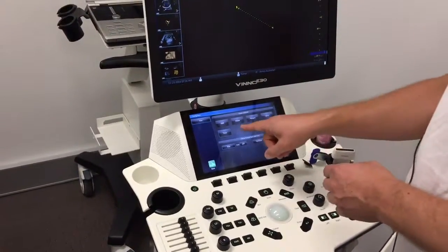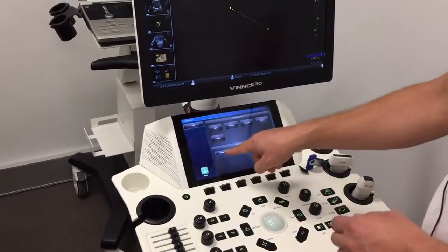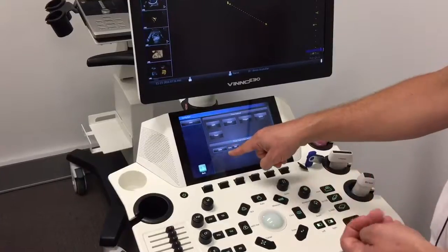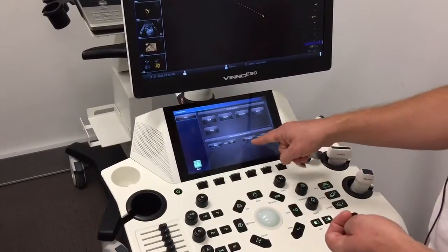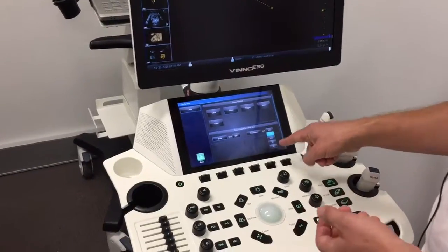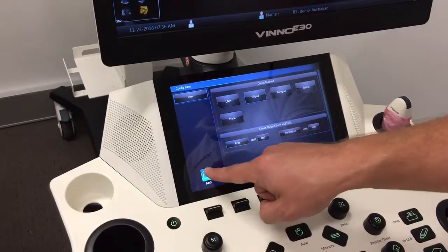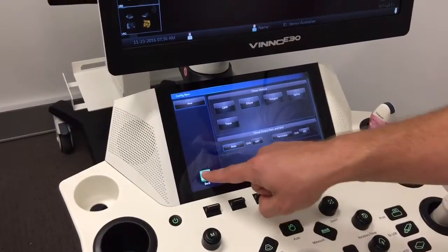For example, some people prefer ellipse to tracing. If we select ellipse, it'll also give you the option of measuring in centimeters squared. The perimeter will give you the option for units; you can choose millimeters, inches, feet, depending on which option you prefer. So let's save that.